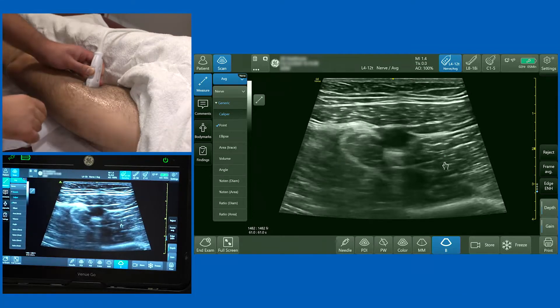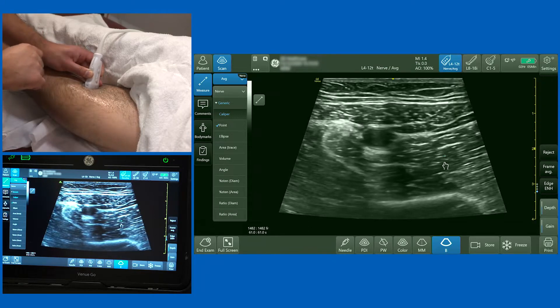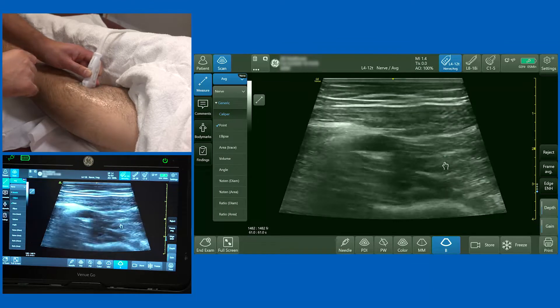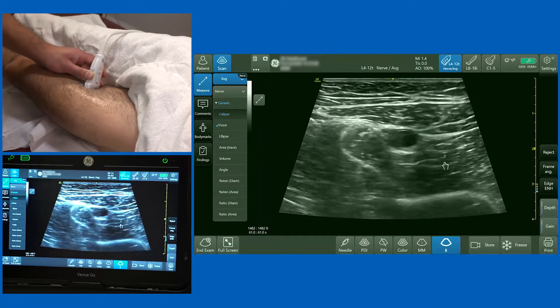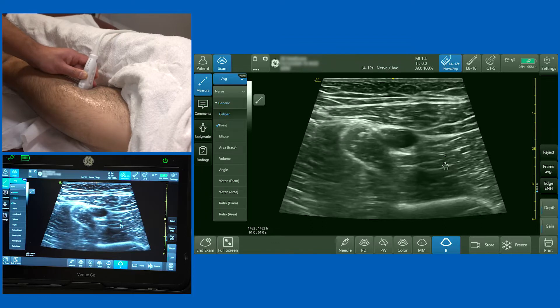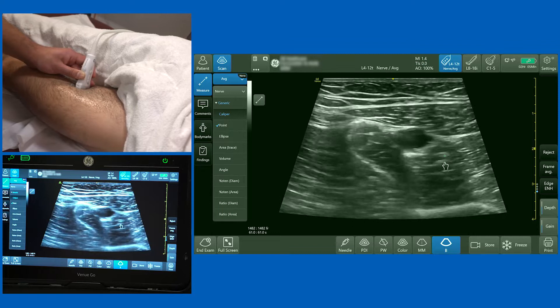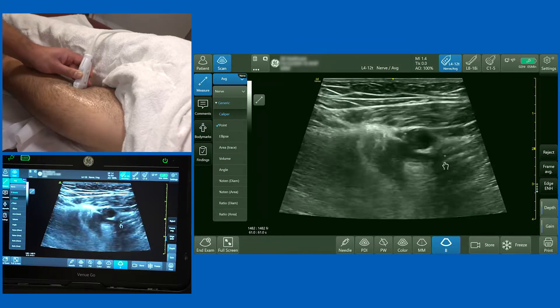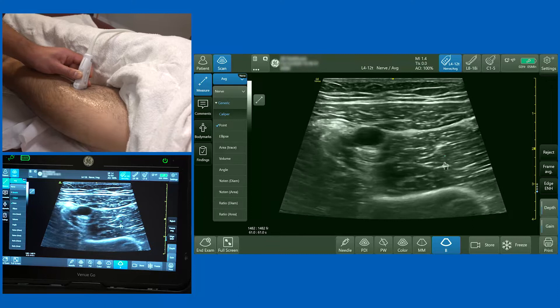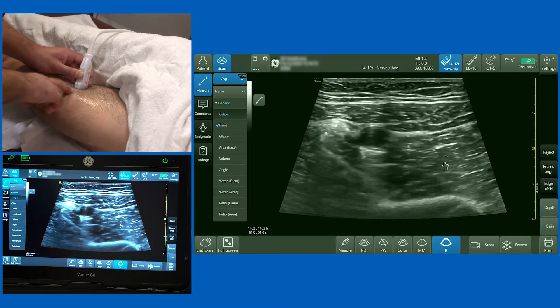On the right-hand side of the screen, which is lateral, is the vastus medialis, and medial to that are the adductor muscles. In order to perform an adductor canal block — or a femoral triangle block, because this is performed at the apex of the femoral triangle — you need to identify the superficial femoral artery and look for neural structures that tend to lie preferentially on the lateral aspect.